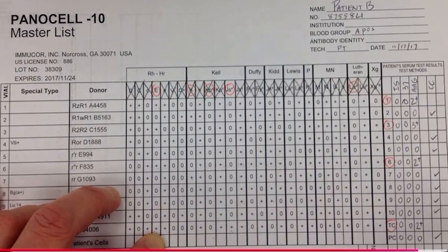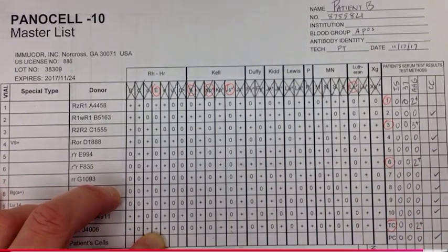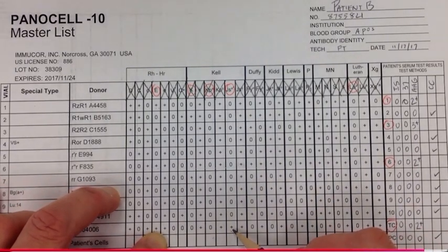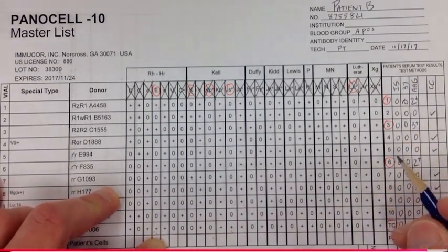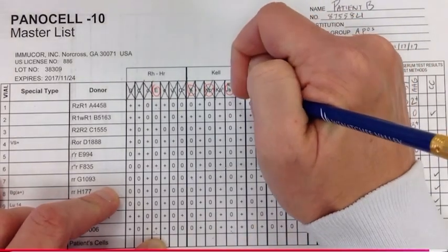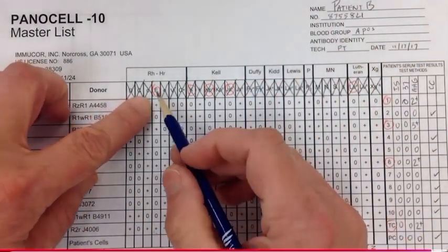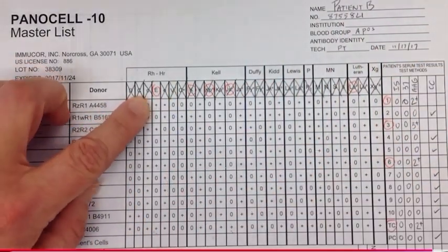Now I did say something about having two cells as far as being heterozygous and ruling out. So your laboratory may require you to get two cells to rule that out. But for us, at this point, that is what I would do. And let's just make the assumption that I did that testing and it came back negative. So that is going to allow me to rule that one out. All right, so that leaves us just with big E.